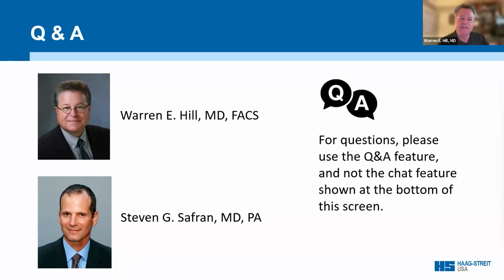As Dr. Safran mentioned, the areas where we want to use the posterior cornea is a PKP patient, somebody with a prior refractive surgery, somebody with prior trauma, something where the posterior cornea is going to be abnormal. And for that, if you have a Pentacam, you can use that. And the Barrett formula, actually for toric IOLs, has the ability for you to enter the posterior cornea.